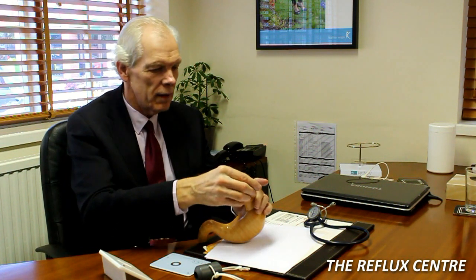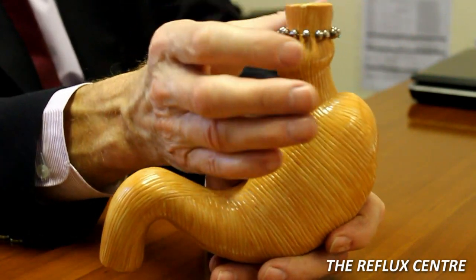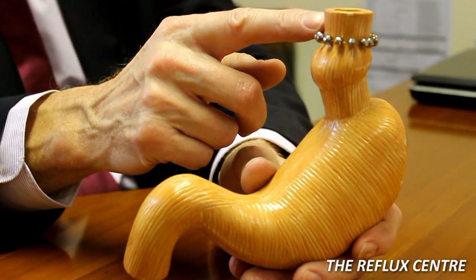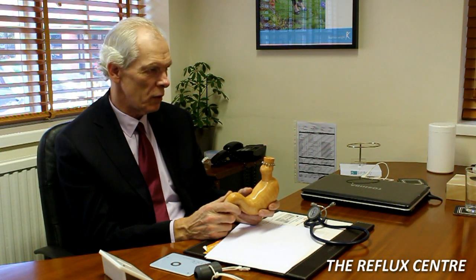The Lynx device is designed to solve that problem. It goes around the lower part of the gullet and reinforces that lower esophageal valve, that lower esophageal sphincter, preventing the stomach contents coming up into the esophagus, but at the same time allowing food to go down. One of the beauties of the Lynx device is that you can belch and you can vomit perfectly normally, so you don't have the disadvantages which are a feature of the Nissen fundoplication.